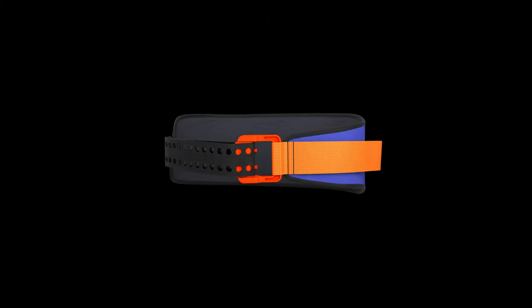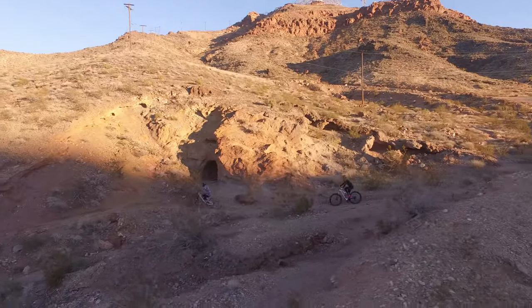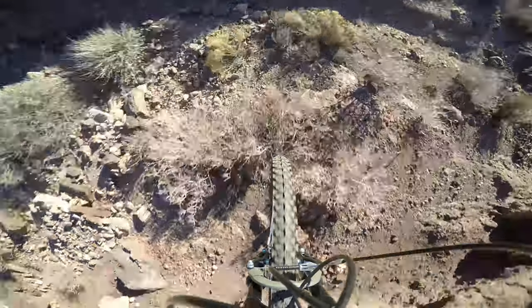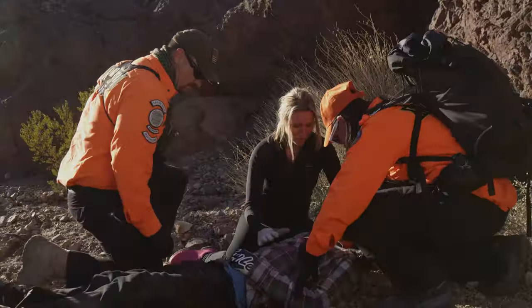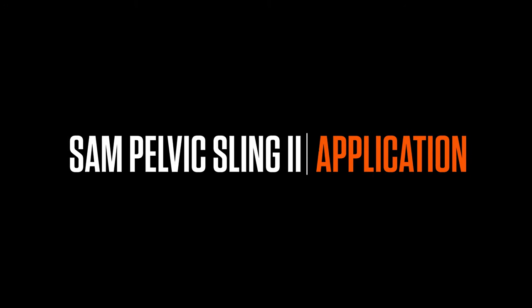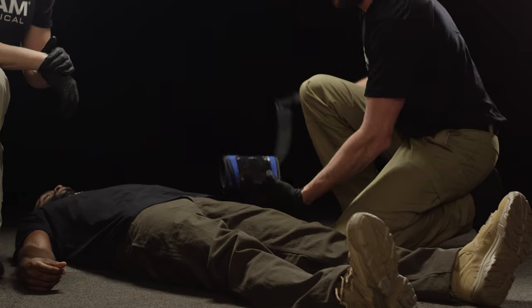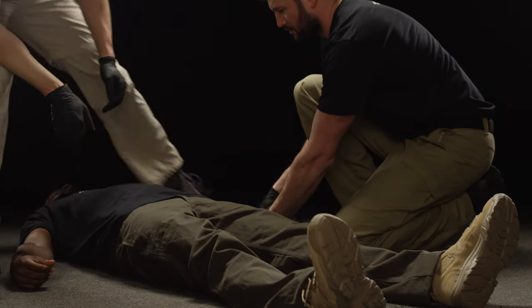This is SAM Pelvic Sling 2 by SAM Medical. SAM Pelvic Sling 2 requires only three basic steps to stabilize a patient's pelvis.